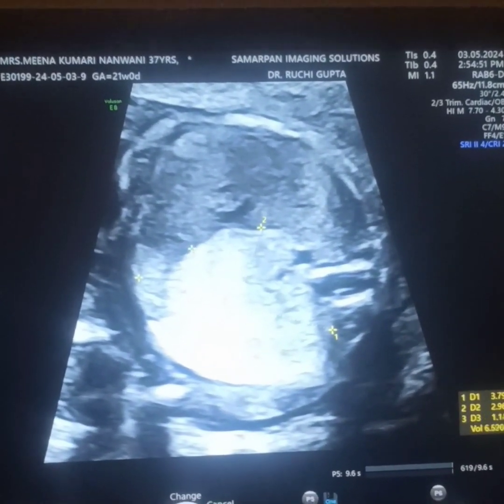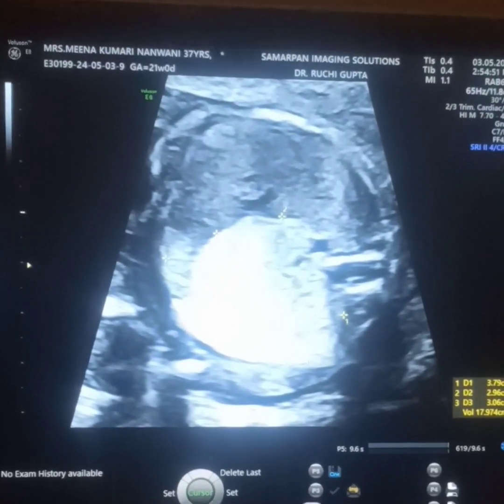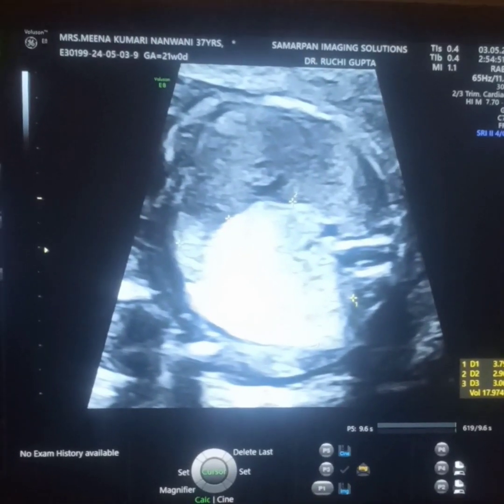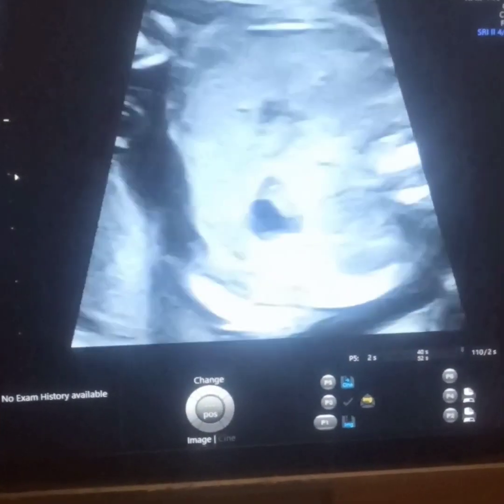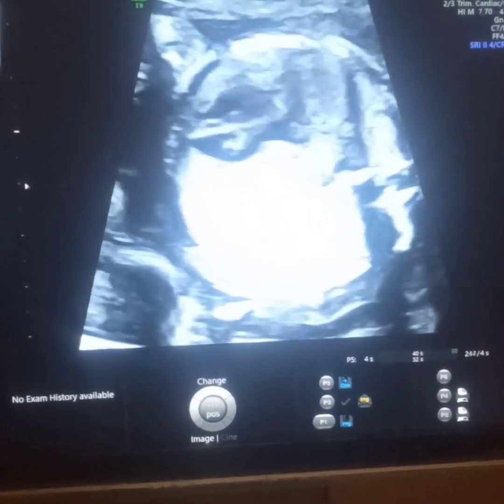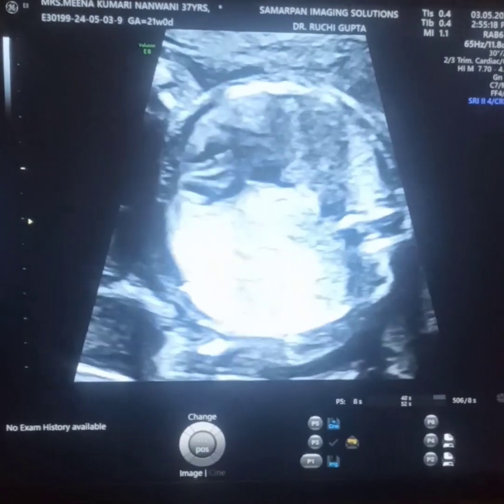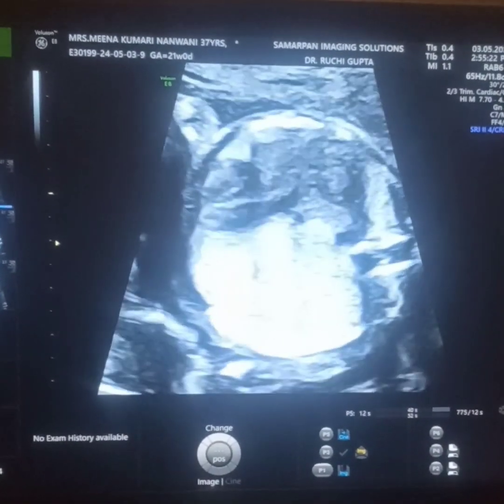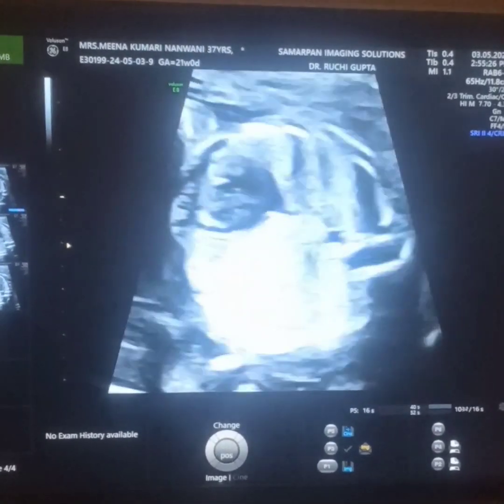As compared to the normal lung volume, the volume is increased. It is around 18 cc, so it is quite large as compared to normal fetuses of the same gestational age. Now to confirm the diagnosis, what you can see suggests the diagnosis of this bright echogenic lung. Mostly if the condition is bilateral, then the diagnosis is likely congenital high airway obstruction.